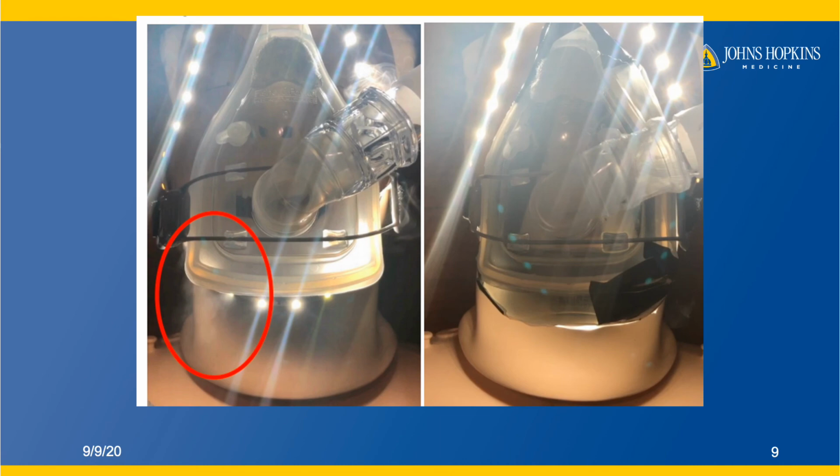Here is the comparison figure. The figure to the right shows the modified CPAP mask with the memory foam attachment, and we see no visible leak originating from the chin area between the CPAP mask and the face. However, the figure to the left shows a normal control CPAP mask without the memory foam attachment, and we do see some leakage that is circled in the red oval.